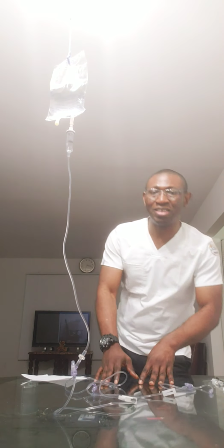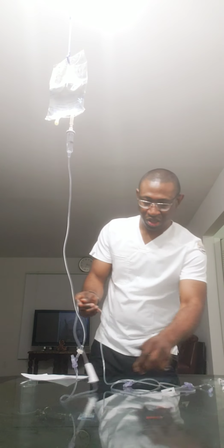Great. There are two routes, two ways: either by existing line or through IV lock. For the existing line, the first thing I'm going to do is check the patency of the IV by checking if there is any infiltration or infection, any redness or swelling. The next thing I'm going to do is flush the IV to make sure there's no blockage.